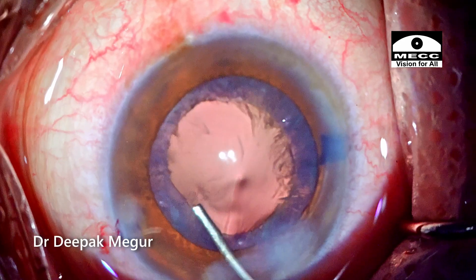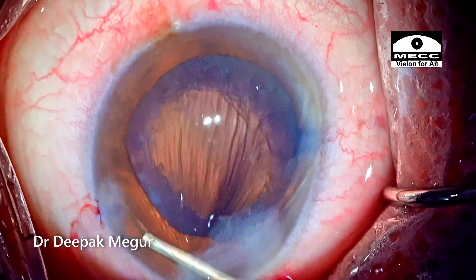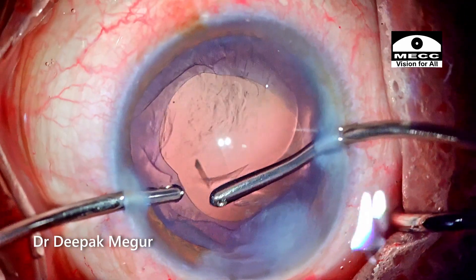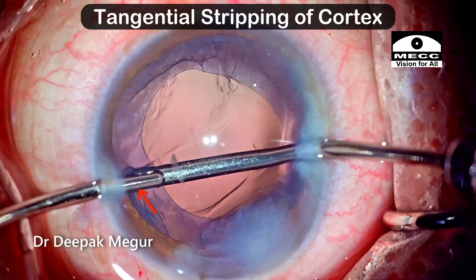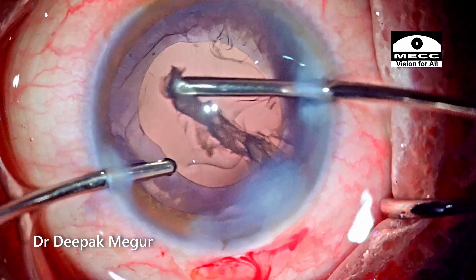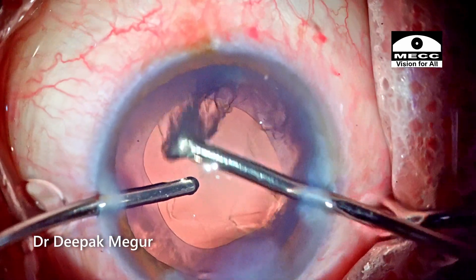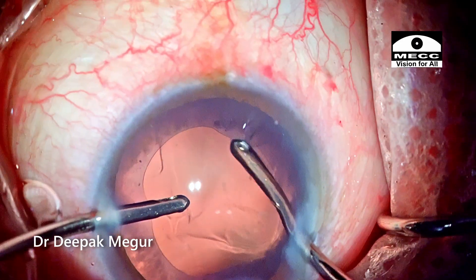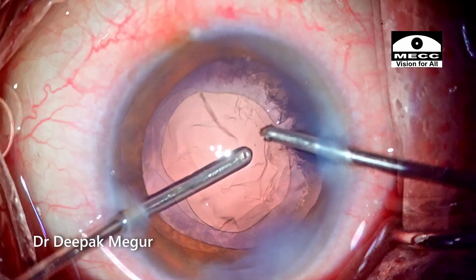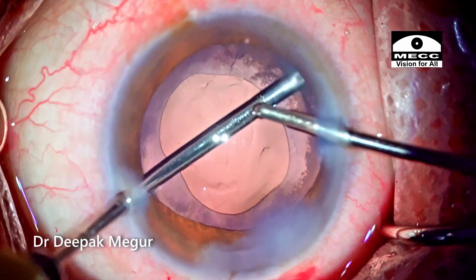I'm flushing the posterior capsule to clean up any lens fiber debris sticking onto it. Time to aspirate the cortex. Note the way the cannula is moved — once it engages the cortex it moves tangentially first, which ensures we don't put stress on the zonules if the cortex is adherent to the capsule. This tangential stripping of the cortex is a nice habit to develop, as it minimizes the risk of inducing stress to the zonules, especially in eyes with compromised zonular apparatus.